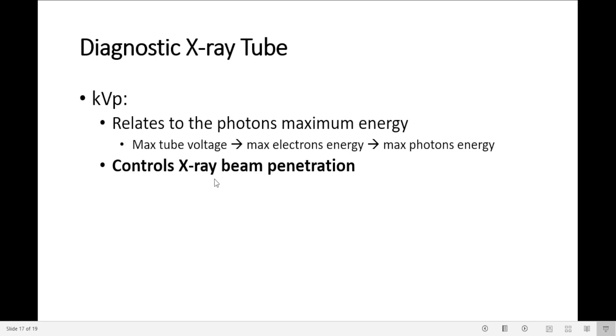kVp controls x-ray beam penetration. The higher the peak voltage, the higher the x-ray's energy, the greater its penetration.